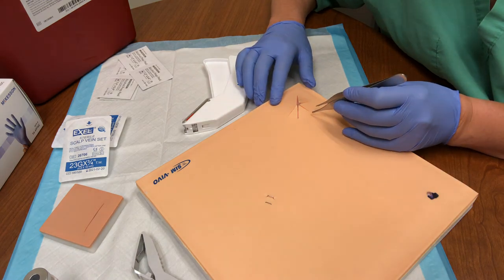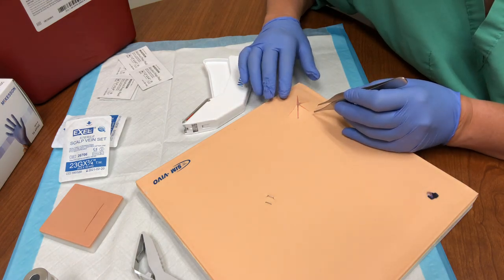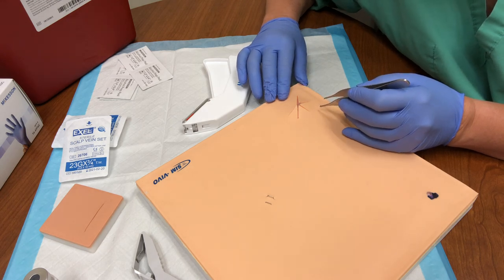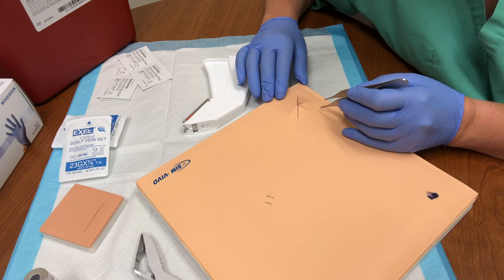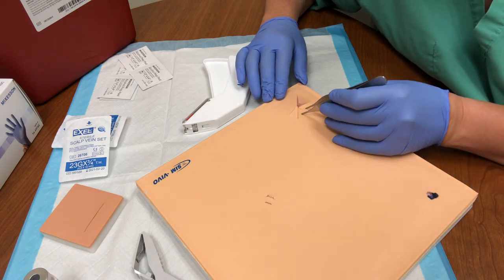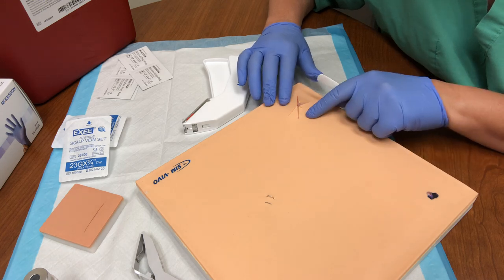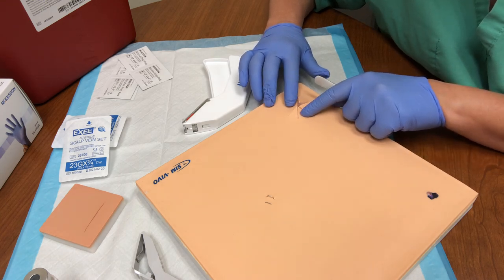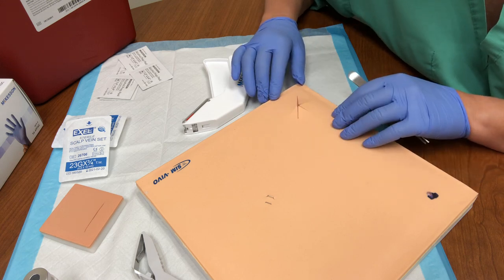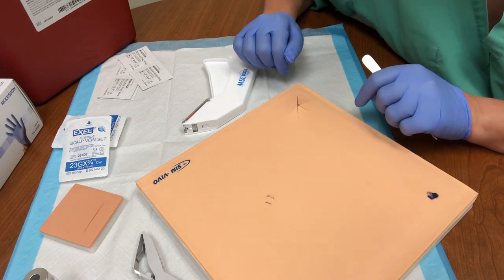So how would you do this? When we talk about suturing, we discuss the rule of halves. Well, that doesn't work here because we have a lot of halves potentially. You could potentially half this part of the laceration and half here, but then you would be concerned about putting too much tension — to where you're not going to be able to pull together that stellate or star-like laceration.